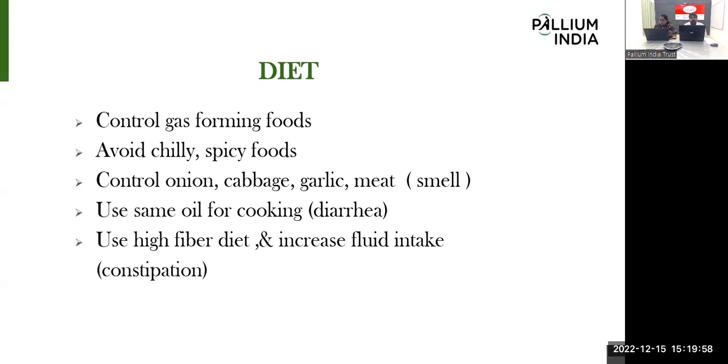Whenever bowel movement happens, fecal matter will come out every time. So loose stool or diarrhea causes more discomfort for the patient. Having to change the bag in between, or opening it, will hurt the patient. So we need to ensure that also.